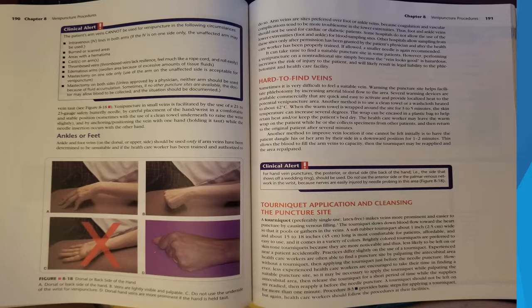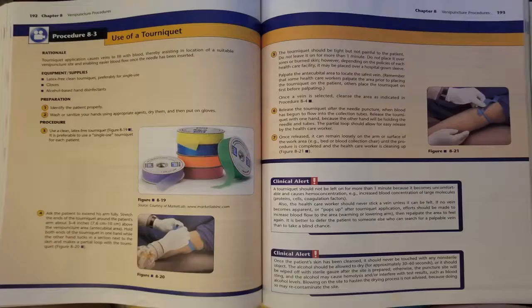A tourniquet should not be left on for more than 1 minute. Procedure 8.3 provides basic steps for applying a tourniquet, but again, healthcare workers should follow the procedures at their facilities. Pages 192 and 193 show procedure 8.3, the use of a tourniquet.